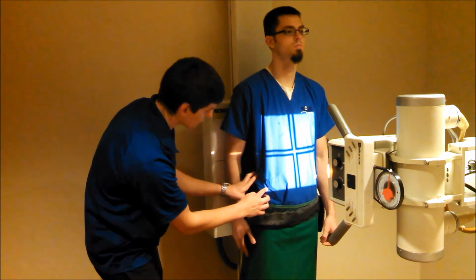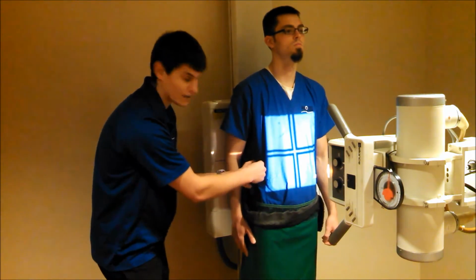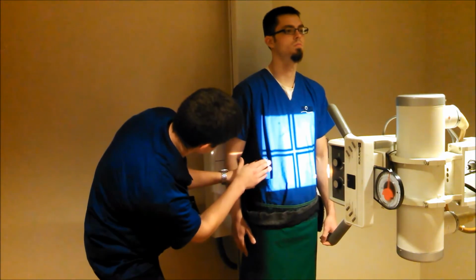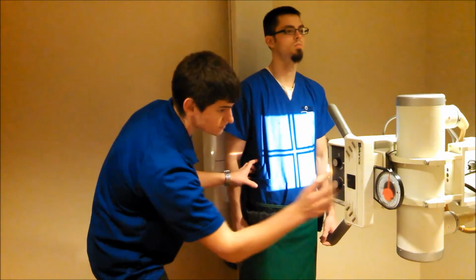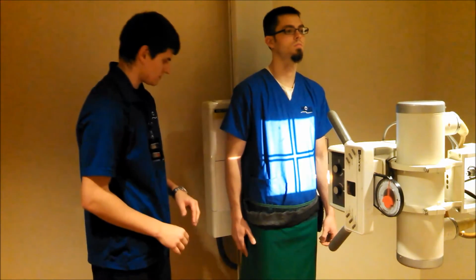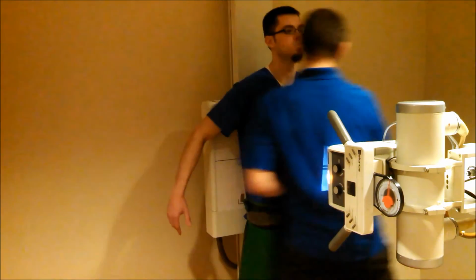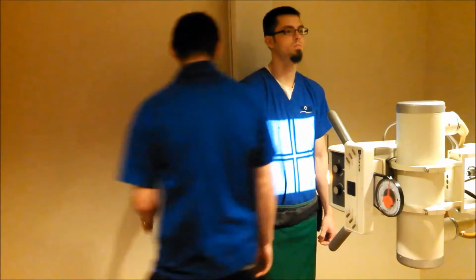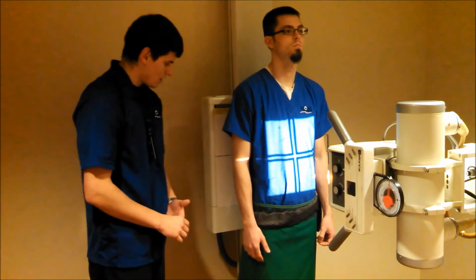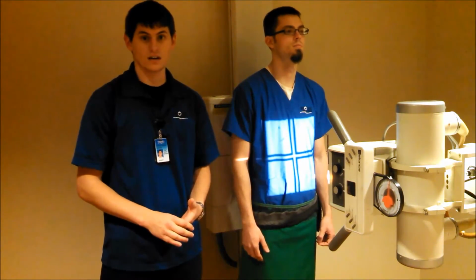And we want to go 2 inches above his crest, because we want to make sure to get the diaphragms on here. So we're just going to come down just a bit there. We're using a 14 by 17 cassette, lengthwise.